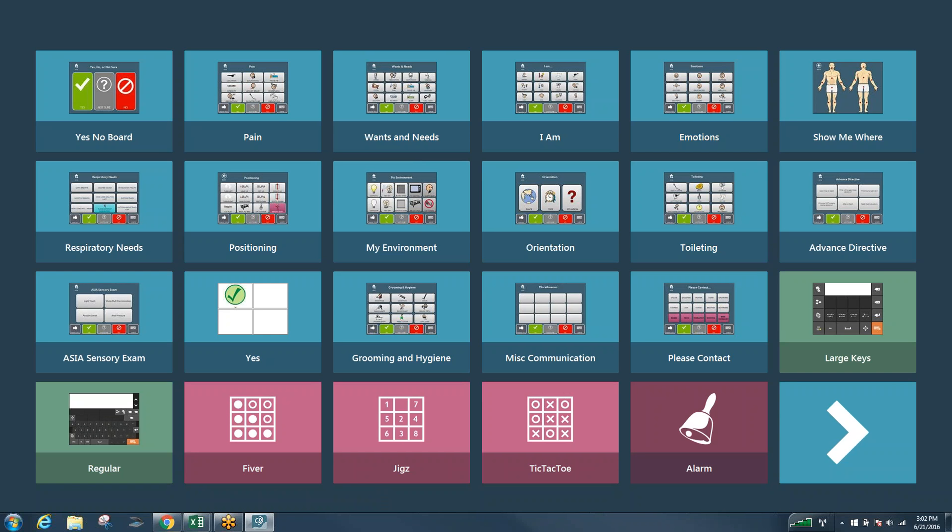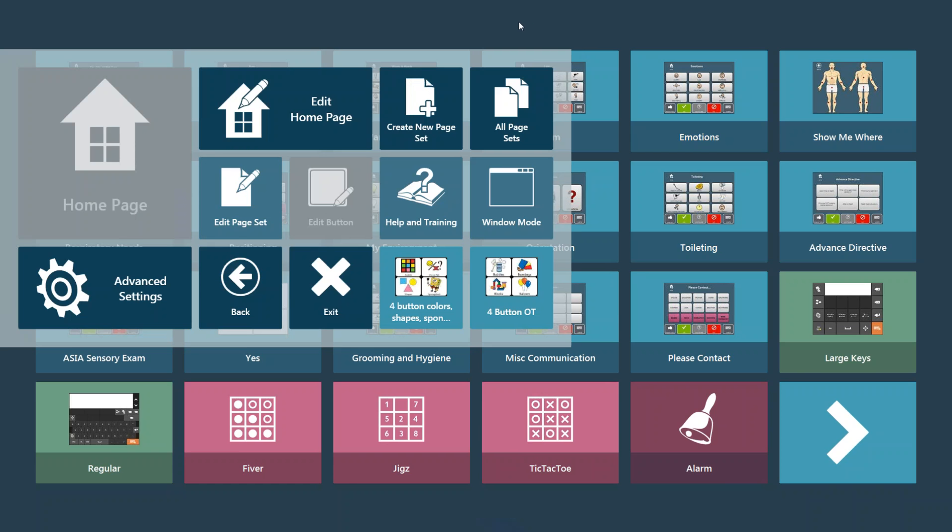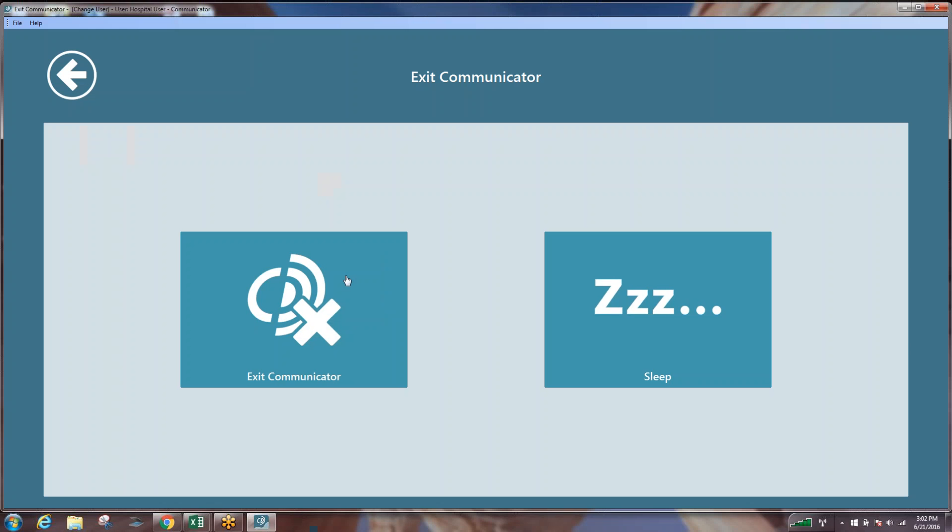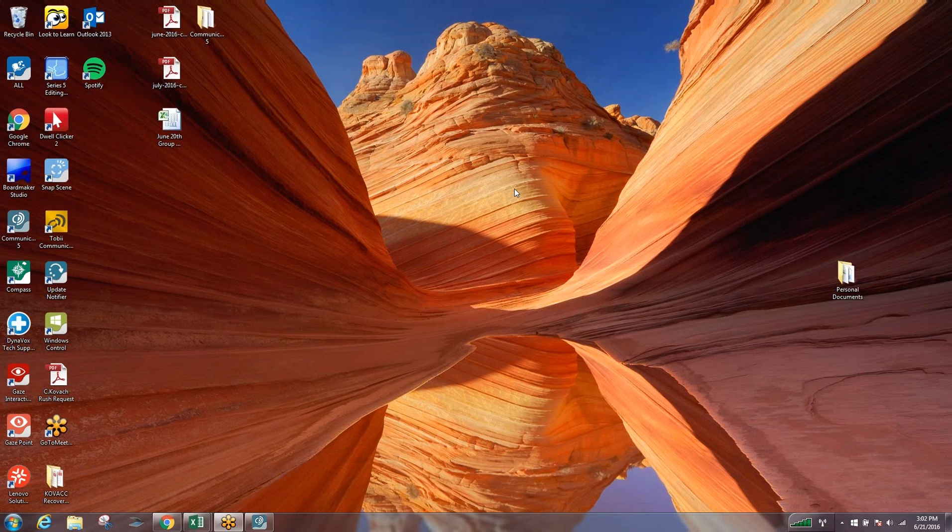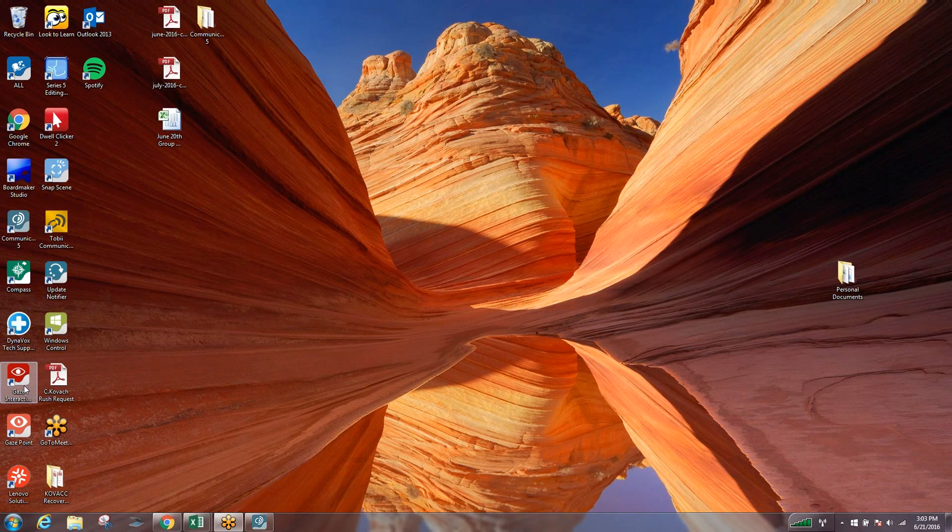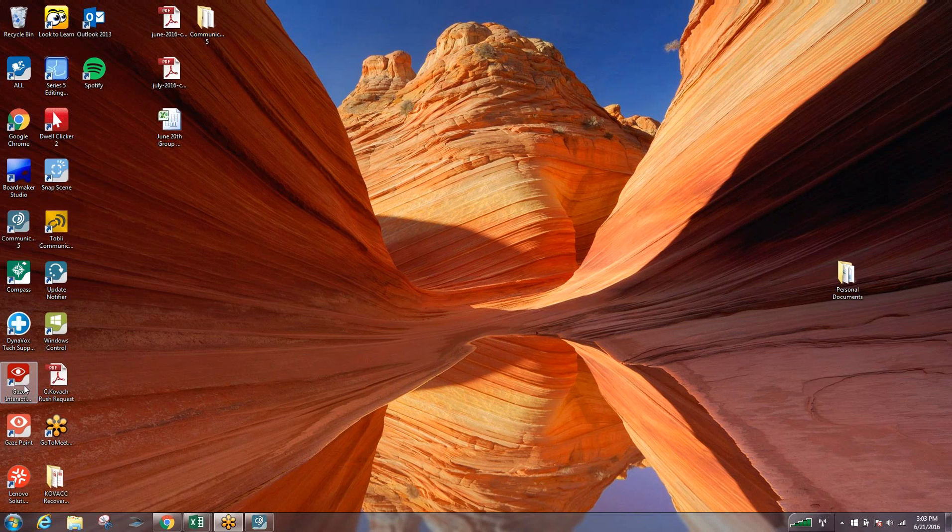The first thing we want to do is start with our proper positioning. What we want to do is go either in through Communicator 5 or if we were on our desktop, on our i-series or on our computer, and get into our gaze interaction settings. The gaze interaction symbol is the red icon that has the white eye located on it.